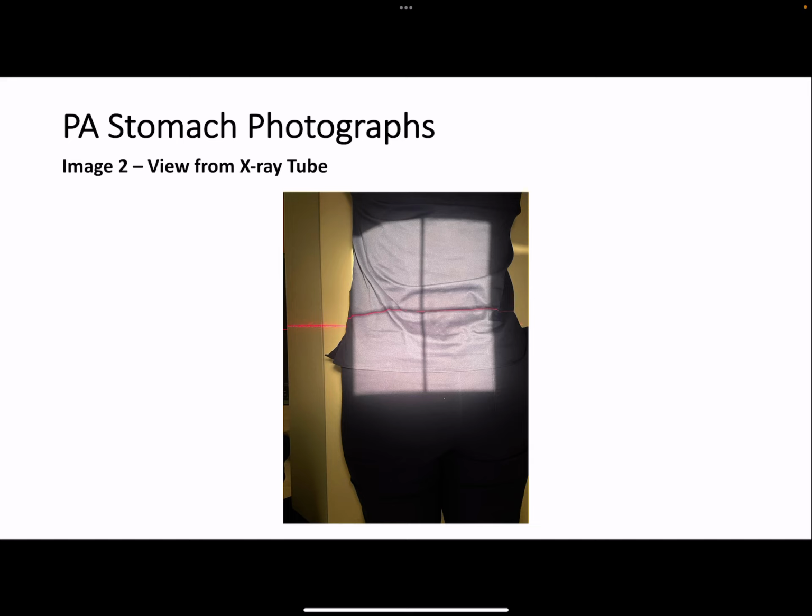Collimated field size. Collimation for this image is centered at the stomach, 1 inch past the left lateral abdominal wall. The right side is just past the spine, superior to the diaphragm, inferior about 1 inch above the pubic symphysis. Visual of appropriate marker location. For this image series, my marker is placed in the lower left corner of the cassette inside the bucky, so it is in the image, but not impeding on any anatomy of interest.